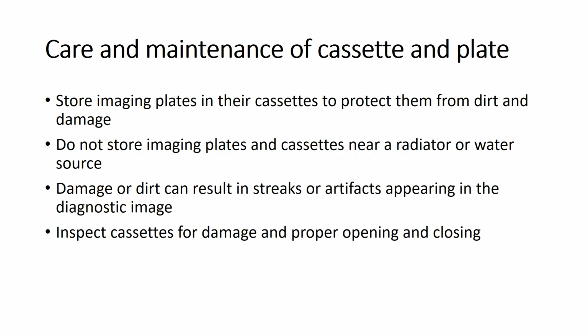One disadvantage is there. The disadvantage is only one: it is costly equipment. Due to the costly equipment, it requires proper care and maintenance of the system.